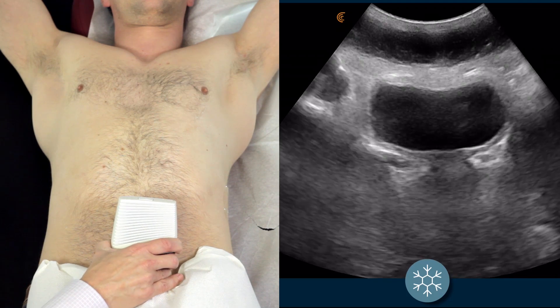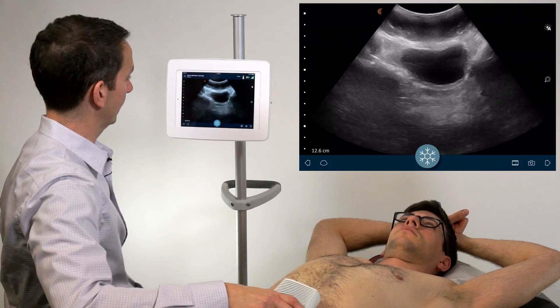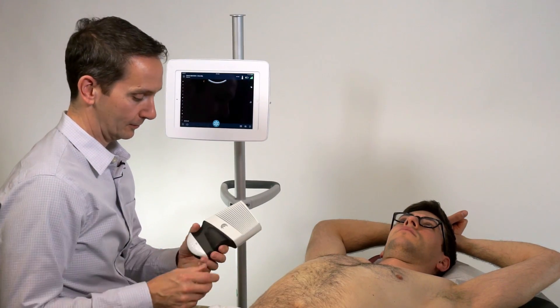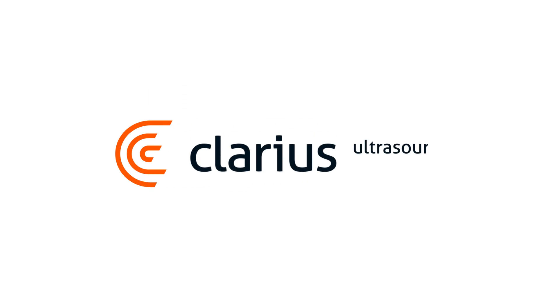The junction spaces of the ureters with the bladder can be another location where kidney stones can get lodged. And that is an assessment of the kidneys and bladder using the curvilinear Clarius ultrasound scanner. Thank you.